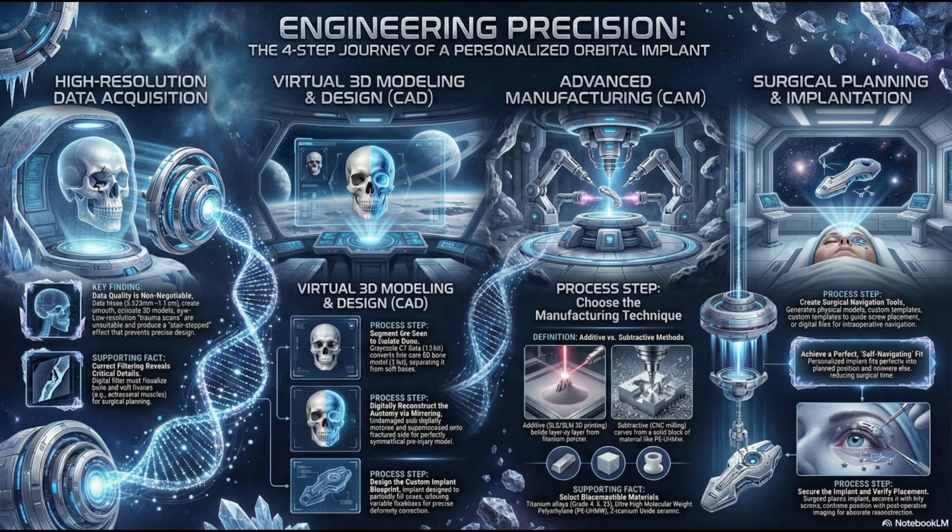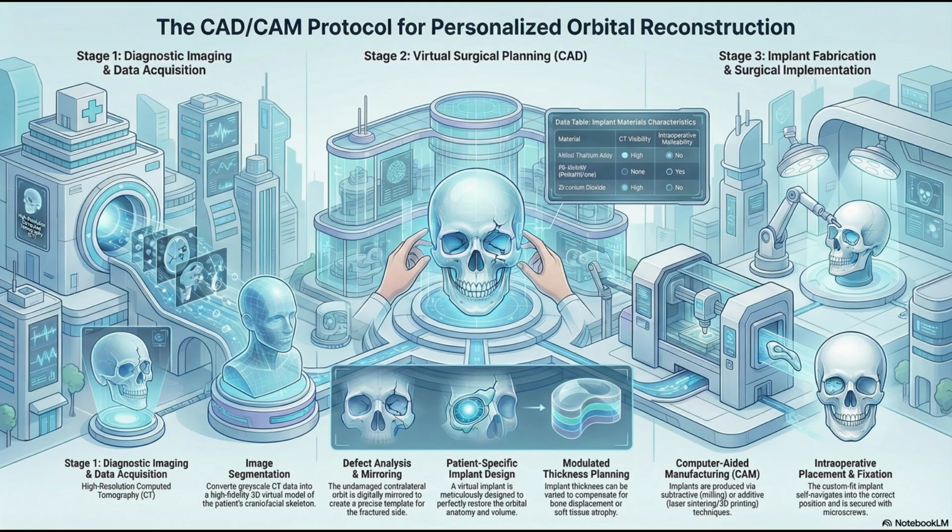Then, the implant's digital file, the STL file, has to be imported and registered into the navigation software. This process of linking a physical, custom-made object to a digital tracking system in real time introduces layers of technical complexity that dwarf the challenges of getting a clean image or even cleaning up pseudo-defects. Success there really hinges on mastering that integration.